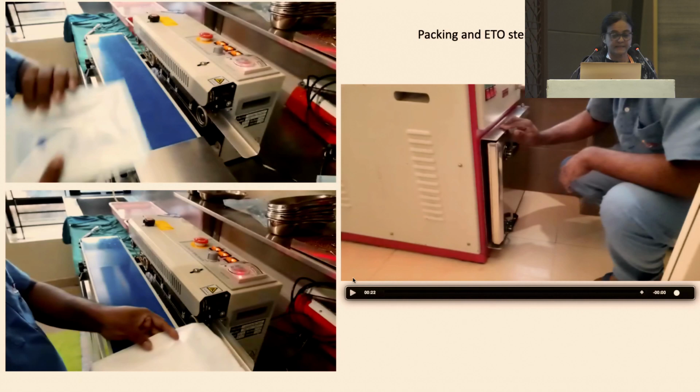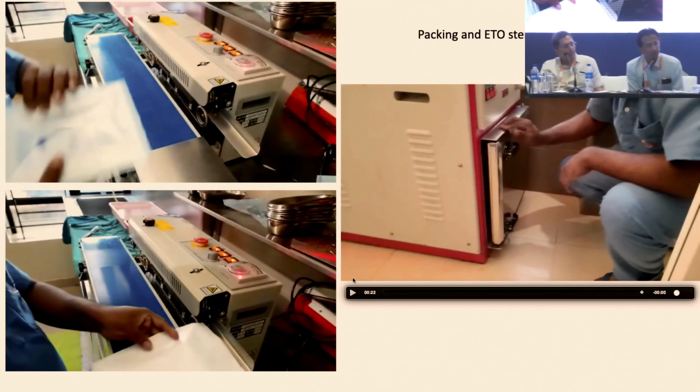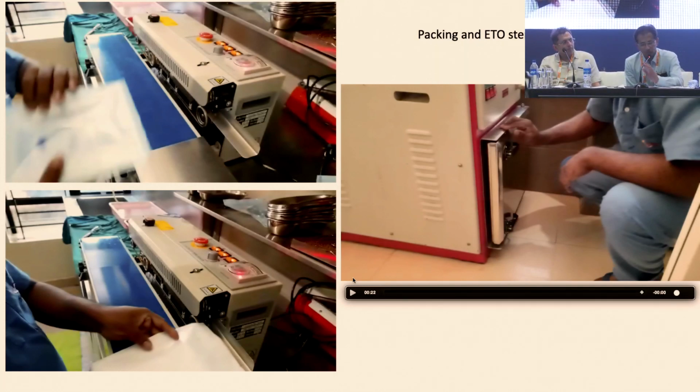The next presentation is by Dr. Mallikarjun Heralgi, he's from Sankarai Hospital, Shivamogga. He'll be speaking on setting up and using a standalone vitrectomy machine. Now, how do you set up and use this? So he's going to simplify for us, and he's going to show us some video on that.